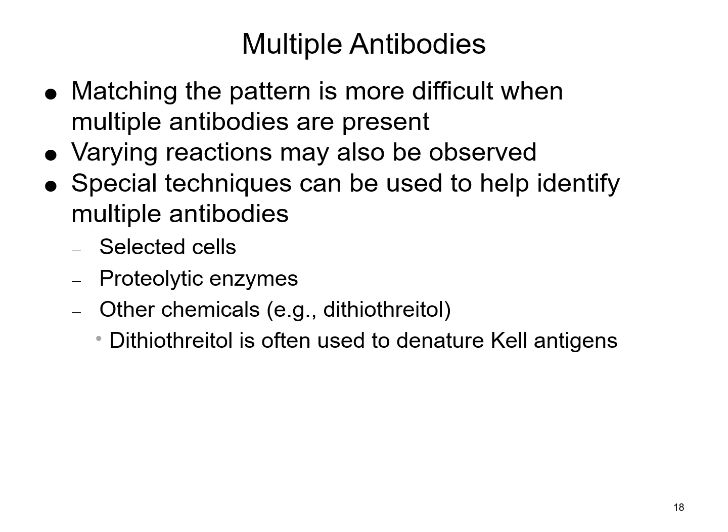When you've got multiple antibodies, this just means you have more than one. So perhaps your patient has an anti-D, but then they've also got an anti-K, and maybe they've also got an anti-Duffy A. When you have those multiple antibodies present, it's going to cause problems because you're running out of cells to work up those antibodies and get those negative reactions to do your rule out. So it starts getting a little more complicated, and you've got a bigger puzzle that you're trying to work.